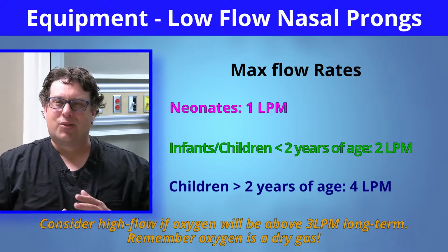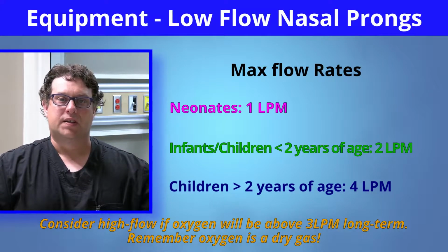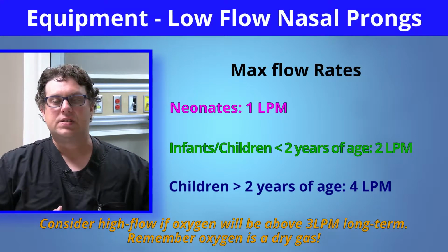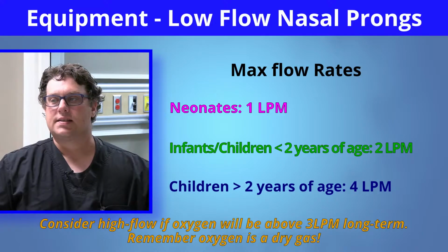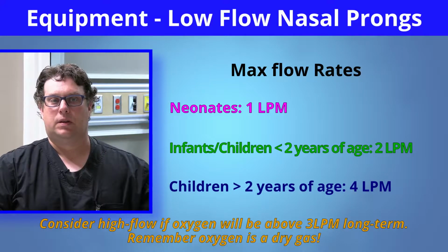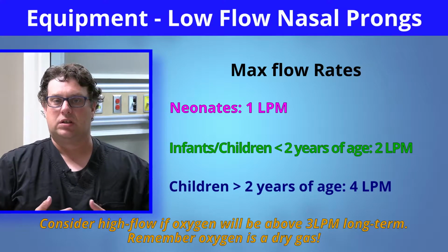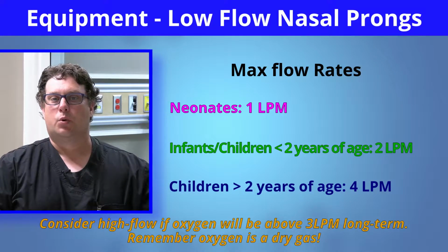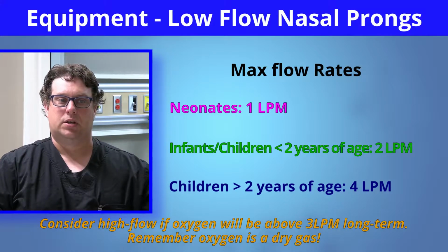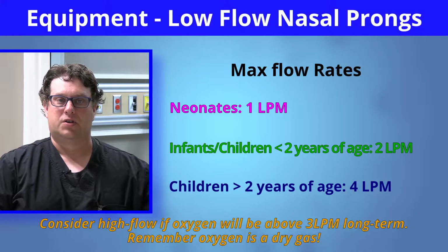Once we get around 3 liters per minute, that's where we typically will start to consider high flow therapy. The reason for that is the gas coming out of the wall is dry and could be very irritating to the patient. When it's heated and conditioned with water, it's much more comfortable therapy for your patient. So do consider that when you're applying your oxygen therapy.